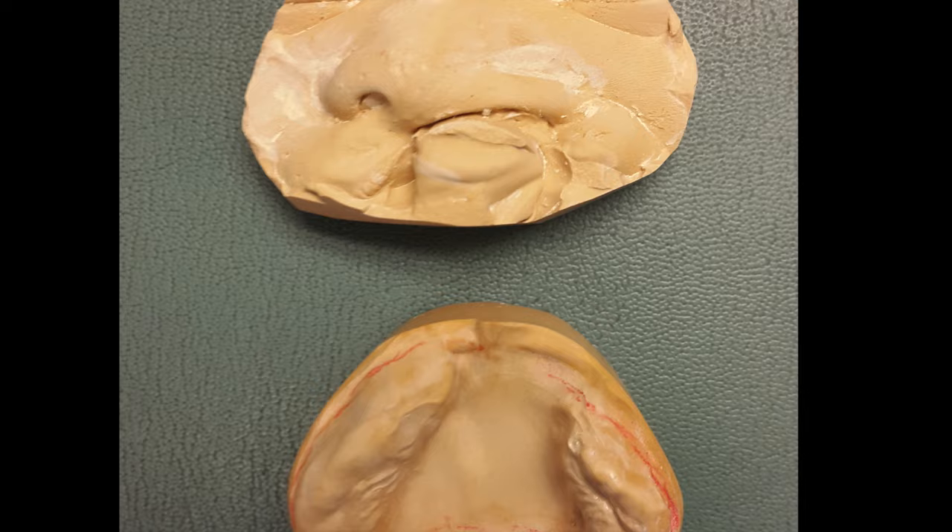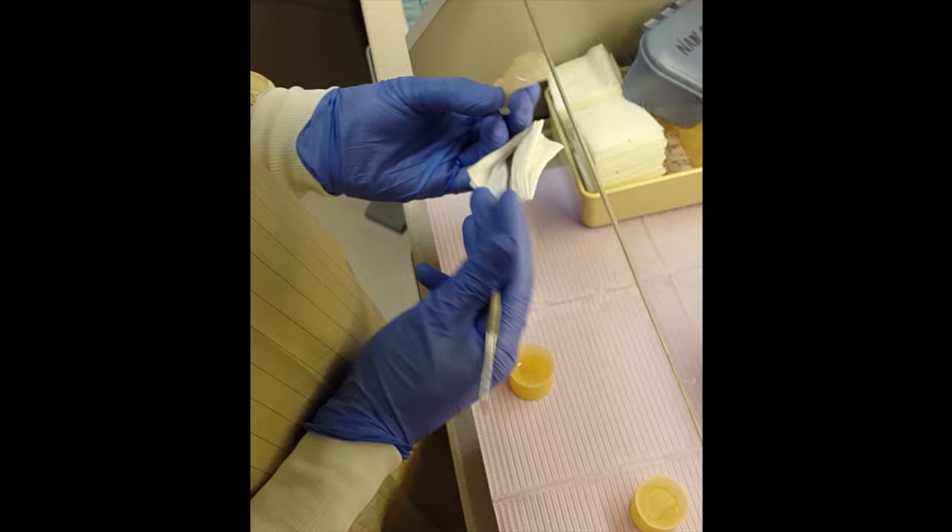To begin NAM treatment, molds of the infant's nose and mouth are taken while the infant is awake. These are used to fabricate a custom appliance which is then adjusted as the infant grows.